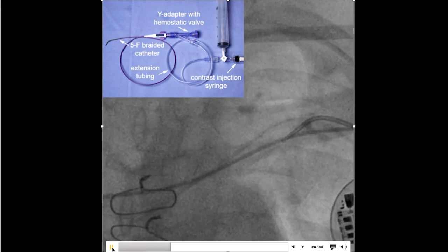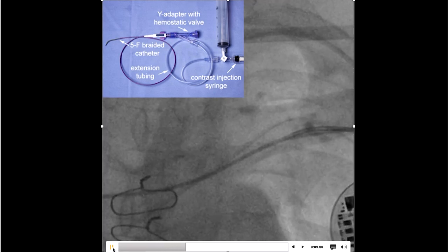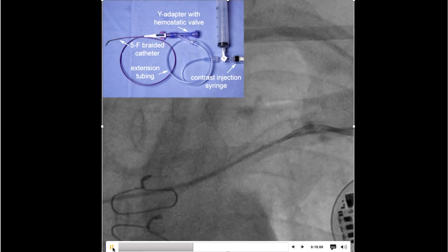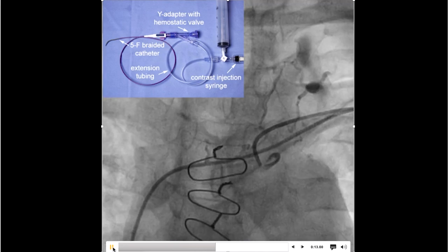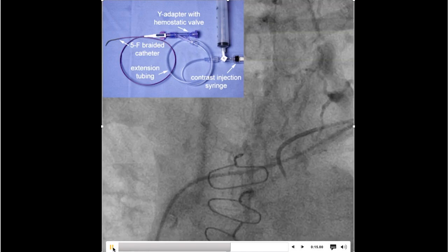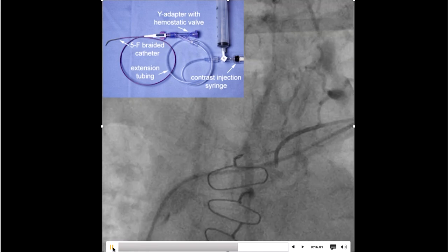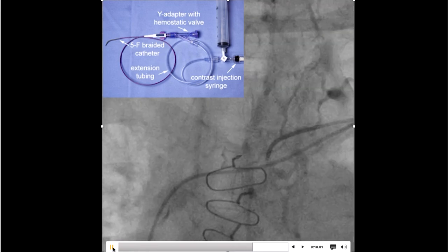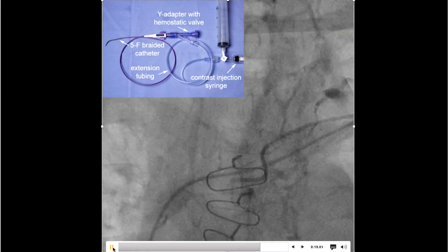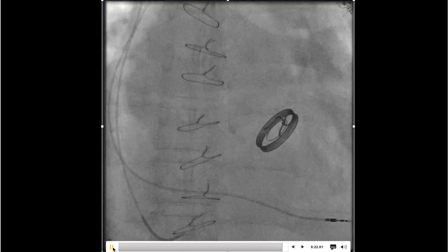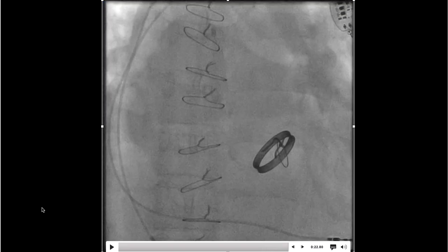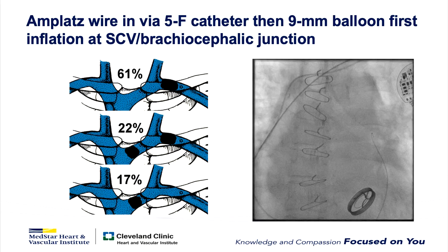We can use the angled hydrophilic catheter just like a glide wire, with puffs of contrast to cross the occlusion. You can manipulate the catheter just like it was a glide wire to get through the obstruction. I like it better because I think of it as a glide wire with eyes — I always know where I am.